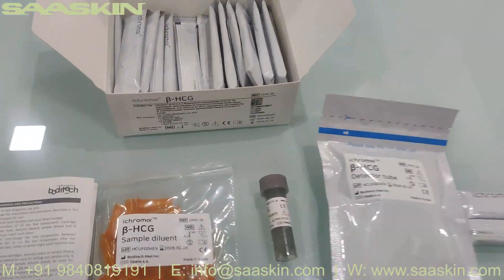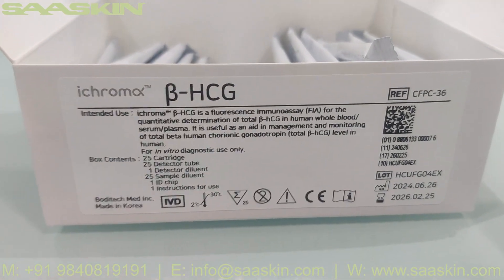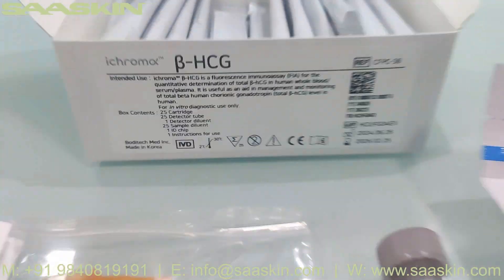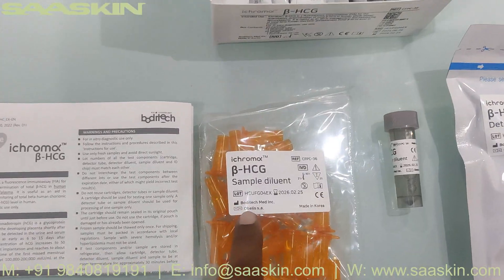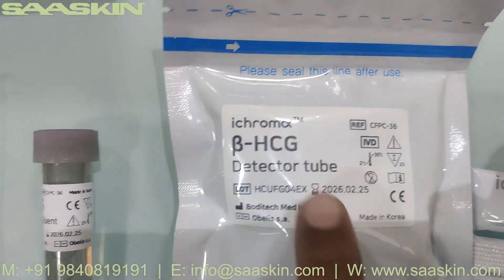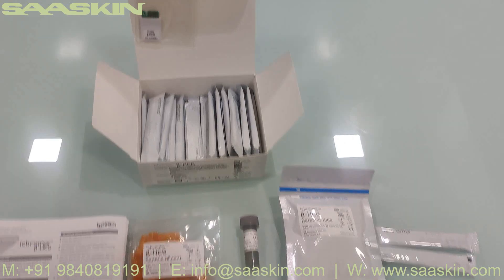To quickly summarize: today we have seen the unboxing of the iChroma Beta HCG test kit, reference part number CFPC-36. This is a 25 test kit pack. In the pack you get one IFU brochure, 25 sample diluents, one detector diluent, 25 detector tubes, 25 cartridges, and one ID chip. This is how the total test kit looks.